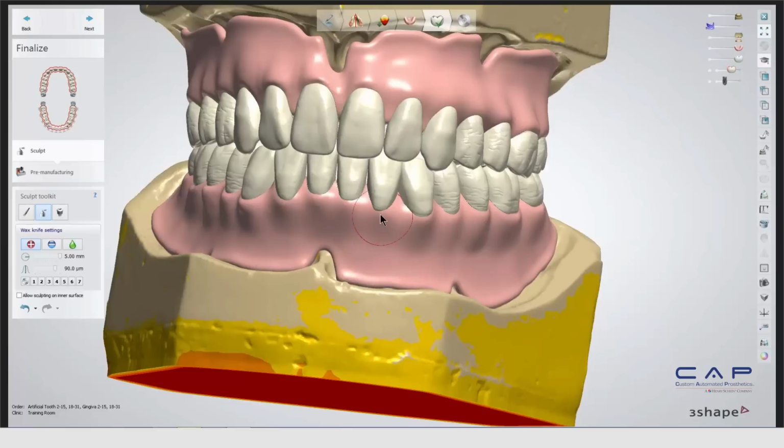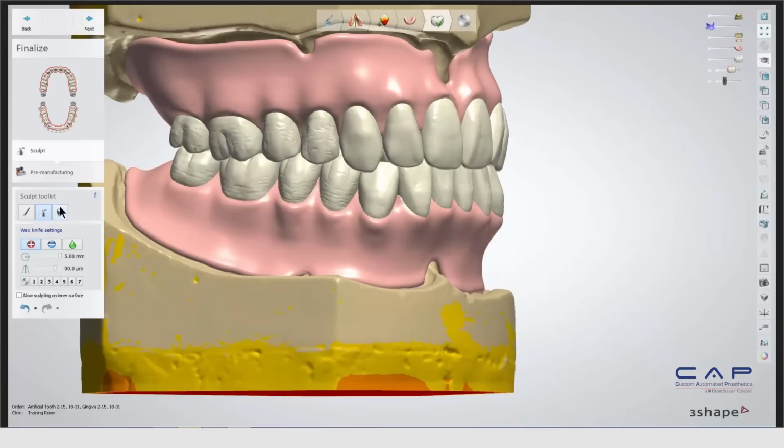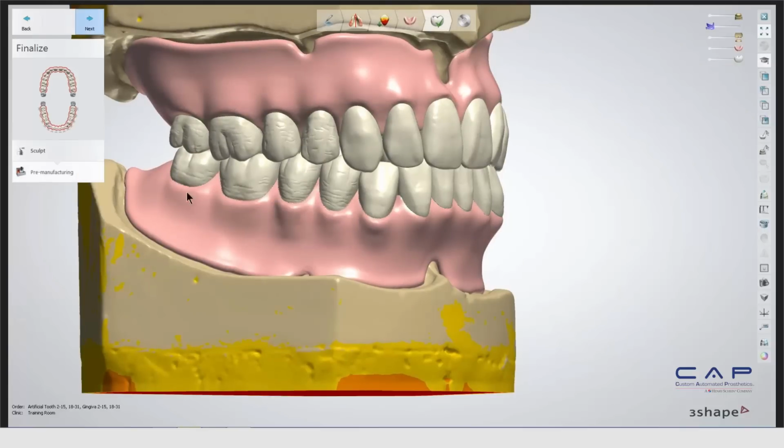Okay, and it's nice because it does leave that little green area on the teeth, so you can see where they should be matching up. Kind of gives you a nice little guideline to design your papilla to. Once you do that, you can then go on to the next stage, which is going to allow us to choose what kind of manufacturing we're doing.